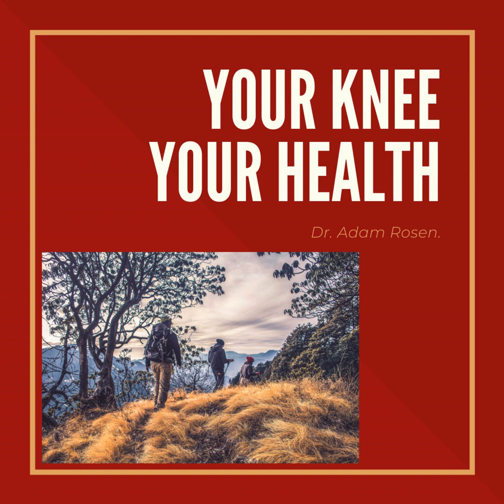On the shin bone, just like the thigh bone, we size it using little oval or lima bean shaped templates. You figure out which size fits the top of the bone the best — it may be a right or left, or some implants are just oval and fit either side. Then you have to set the appropriate rotation. There's a lot of three-dimensional balancing that goes on with these knee replacements to make sure the knee bends and straightens in its normal fashion and the ligaments are well balanced.